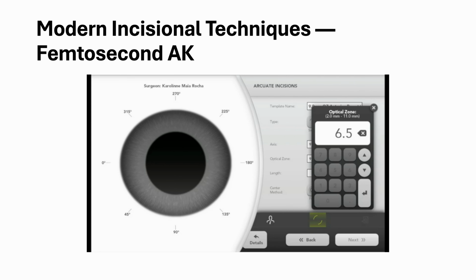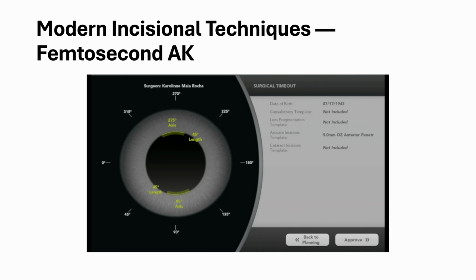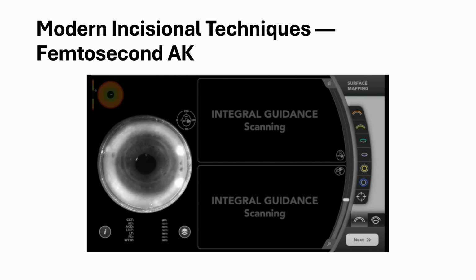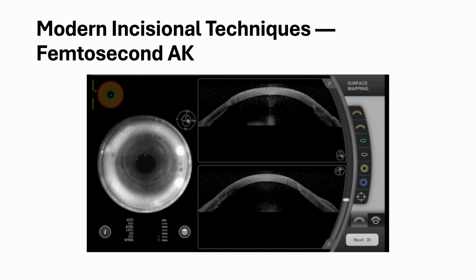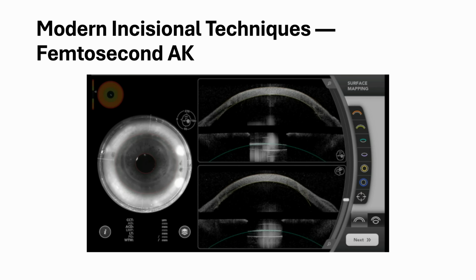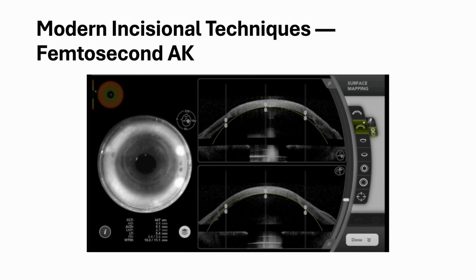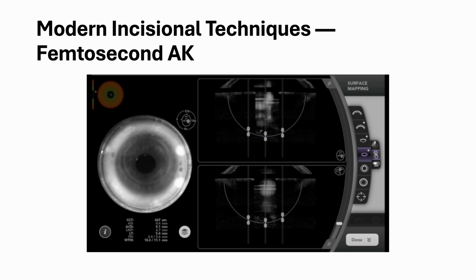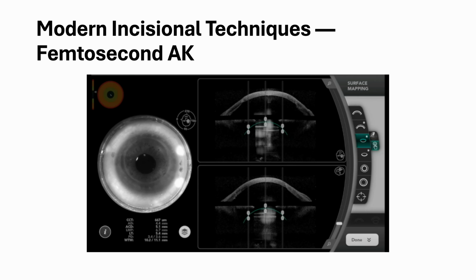Femtosecond laser-assisted astigmatic keratotomy, FLAC, is an incisional surgical procedure in which arcuate incisions of about 80 to 90% depth are made in the steep meridian of the mid-peripheral cornea at the 7 to 9 millimeter optical zone. FLAC, AKs, and LRIs are similar in that both have coupling ratios of 1. Therefore, they correct astigmatism without inducing a significant hyperopic shift.